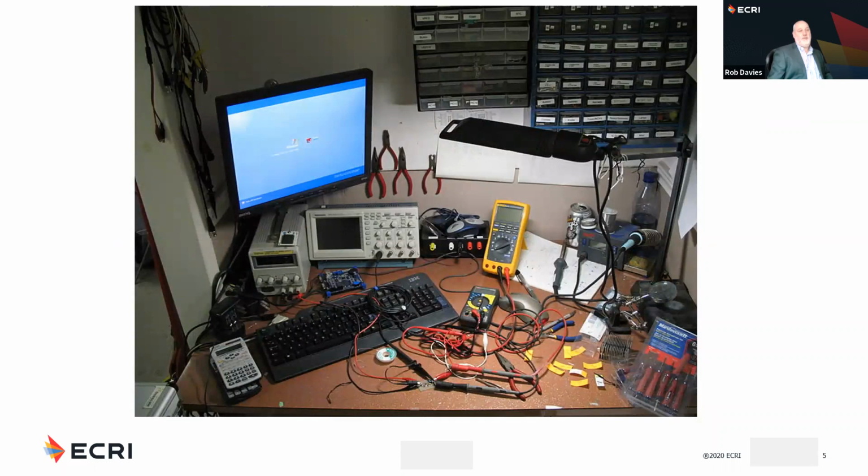This is a fairly common scene now of a common workbench in a department. You'll see that there's screwdrivers and soldering irons, but more commonly what you'll see now is a screen with a keyboard and mouse. And technicians will be looking up equipment details, recording maintenance history, plus they'll be looking up service manuals and ordering parts, etc. So this is a more common sight nowadays.